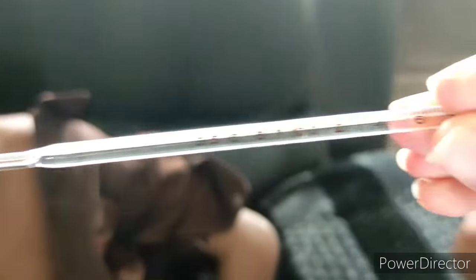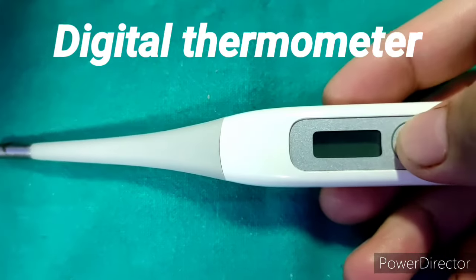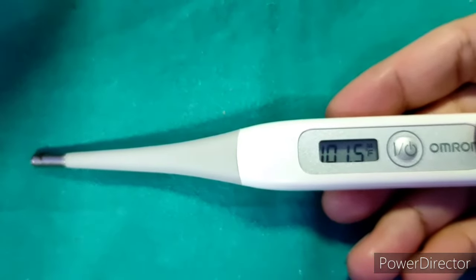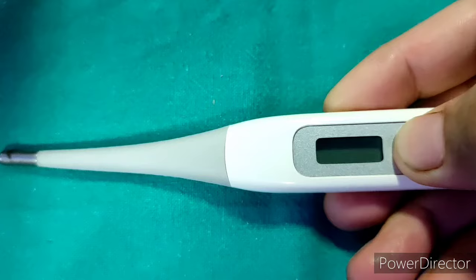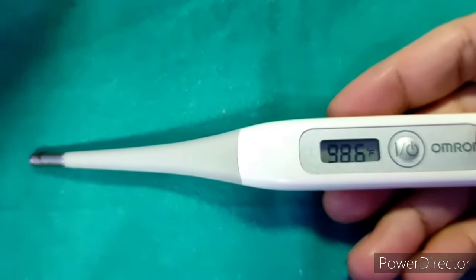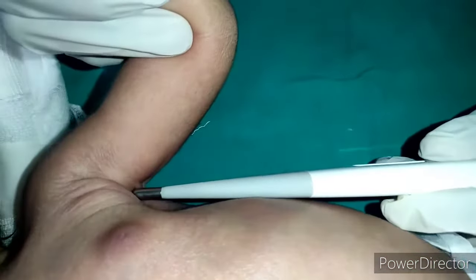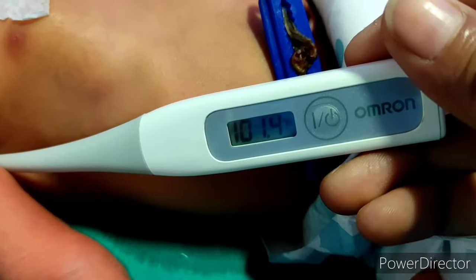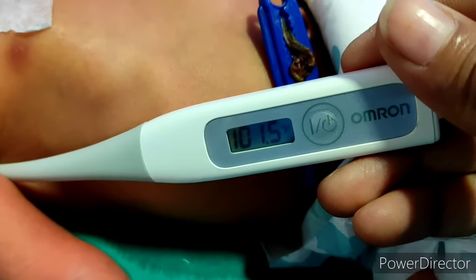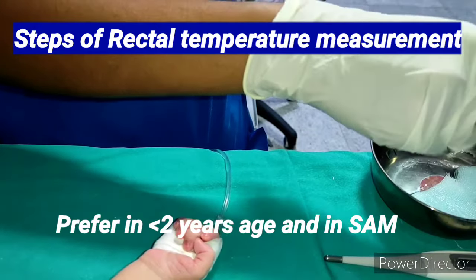Nowadays, instead of a mercury thermometer, we usually use a digital thermometer. When you press the button, there is a beep sound — this is a functional check. For the next three seconds, it will show the last recorded temperature, and again there will be a beep sound indicating it is ready to use. I am now putting this thermometer into the apex of the axilla of a newborn. When the temperature is recorded, there will be another beep sound. The reading is 101.5.